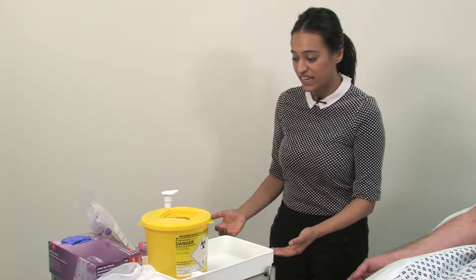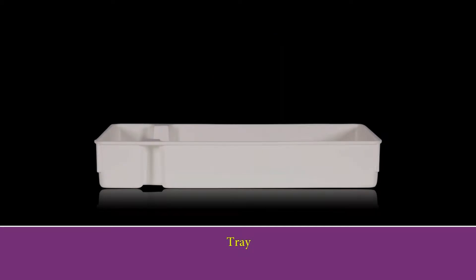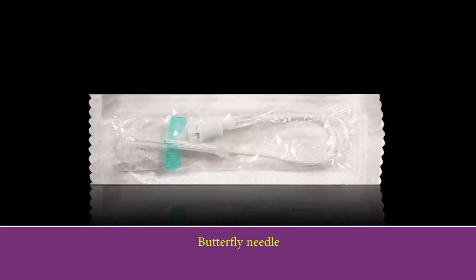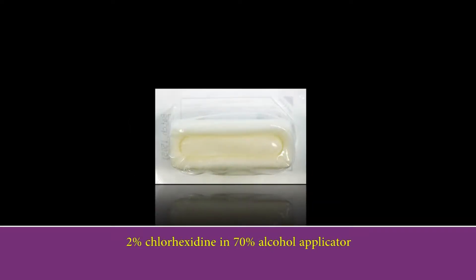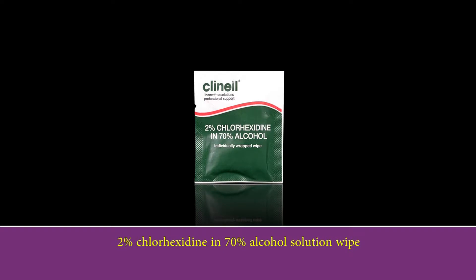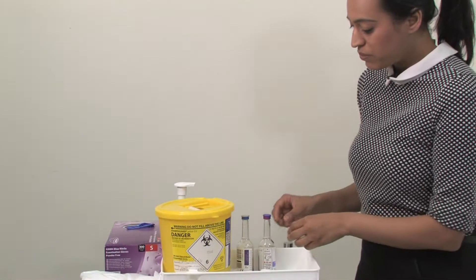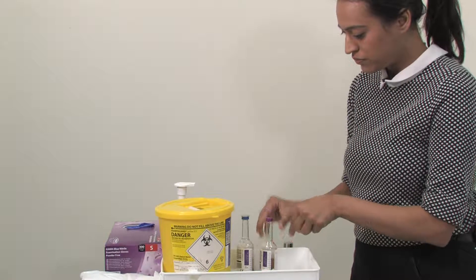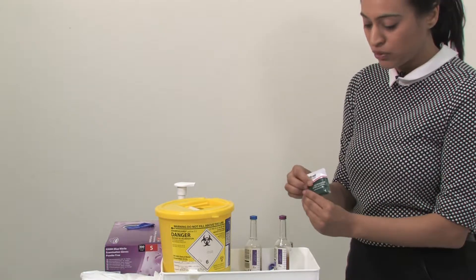Next we can prepare our kit. You will need a sharps bin, a trolley, a tray and your blood culture kit. This consists of two bottles, a butterfly needle, a blood collection adapter cup, a 2% chlorhexidine alcohol applicator and a 2% chlorhexidine wipe. It's important to check the expiry date on your blood culture bottles, which can be found on the side of the labels. The next step is to take the tops off our blood culture bottles and wipe them using the 2% chlorhexidine wipe.